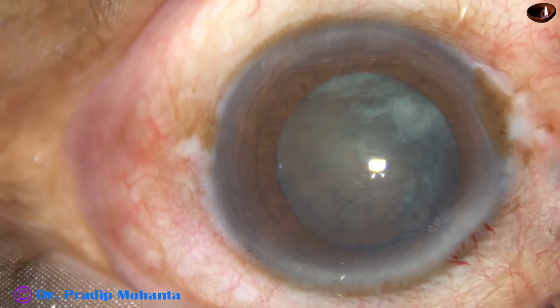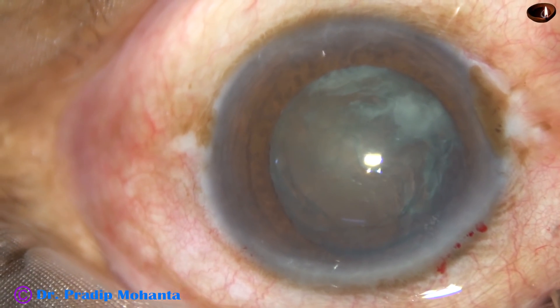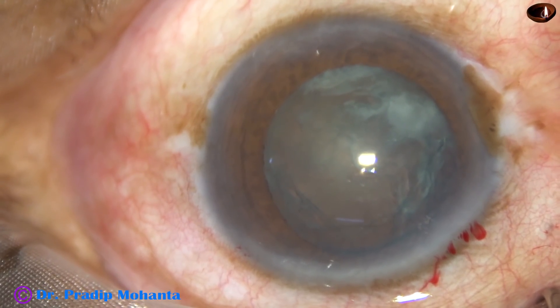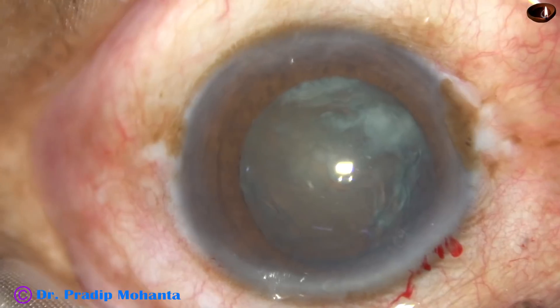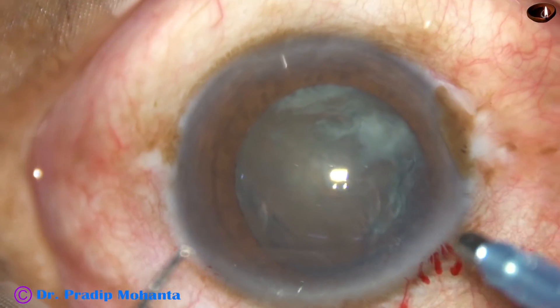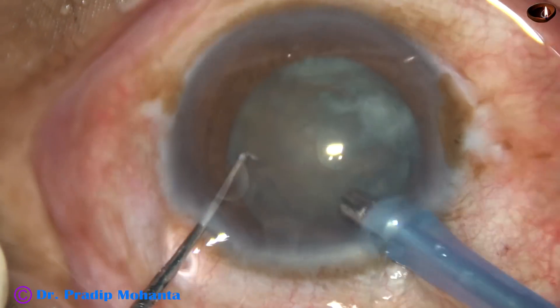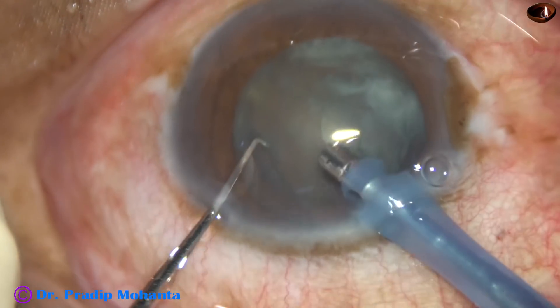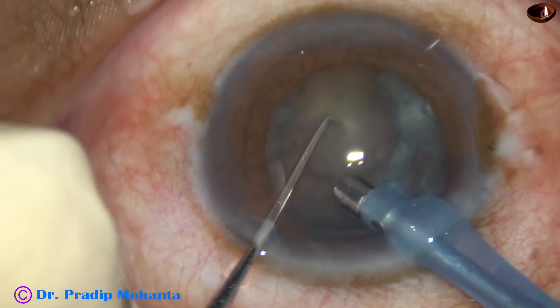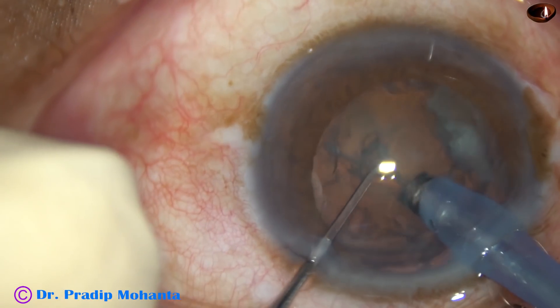Visco — 2% HPMC — is again injected into the anterior chamber, and then the tip of the phaco handpiece is introduced into the anterior chamber. The tip goes bevel down first, removes some superficial cortical lens matter, and this maneuver increases visibility throughout the surgery.